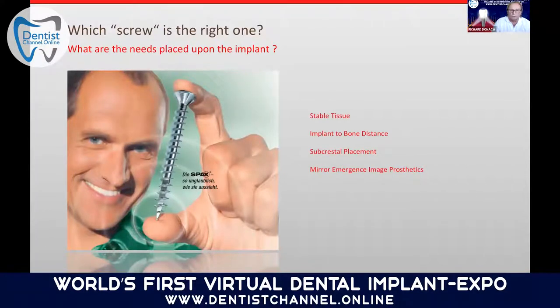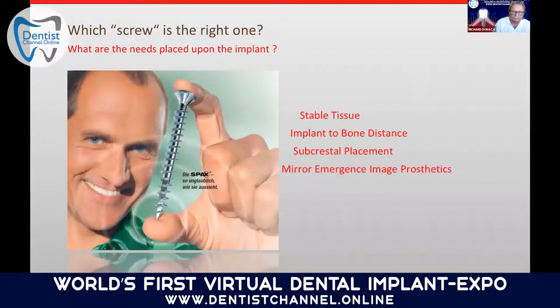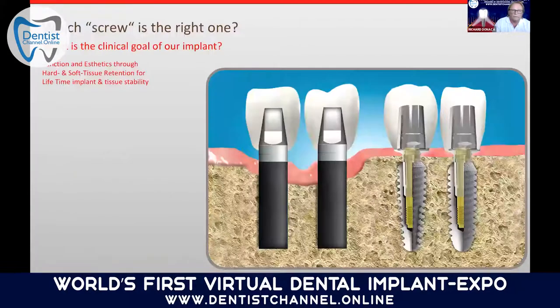Which screw is the right one? Where are the needs placed upon the implant? We need stable tissue. We need implant to bone distance. We need subcrestal placement. And we need mirror image prosthetics. The clinical goal of our implant is, of course, the function and the aesthetics, through hard and soft tissue retention for lifetime implant and tissue stability.